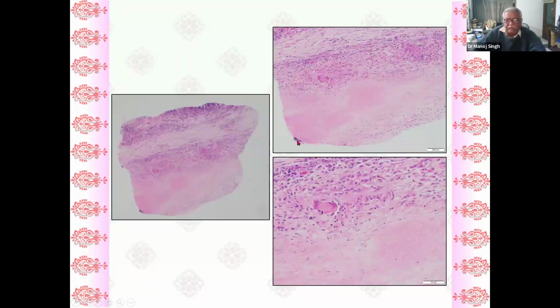And something which you do not often see, but is a part of the classical granulomatous reaction, necrosis in leprosy. Usually, it's much more common in tuberculosis, of course, but at times in leprosy, you may see necrotic reaction. So this, when it's present in the dermis, may look, in fact, like a tuberculoid leprosy, like a tuberculosis.